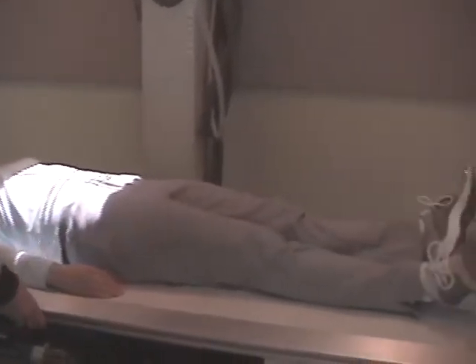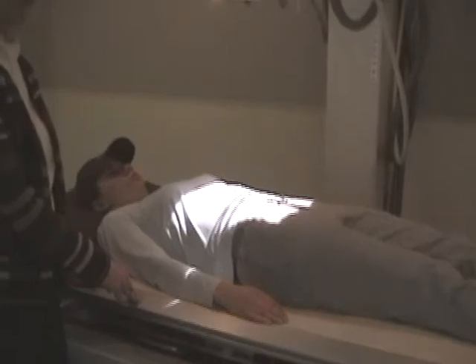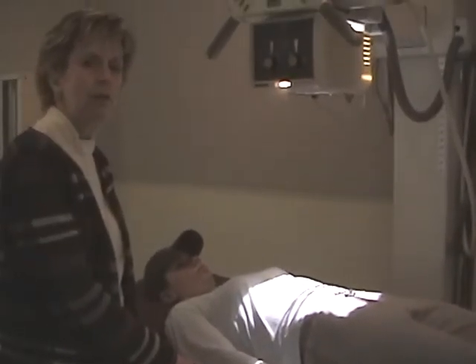And then you can float your table to have the mid-sagittal plane to the center of the film, and the center of the film is at the level of the iliac crest. Okay, you can see your iliac crest there is right to the center of the film. Now we're not after air fluid levels on the recumbent, on the KUB. So we want the abdomen demonstrated in its full capacity. Therefore, we want to elevate the diaphragms.